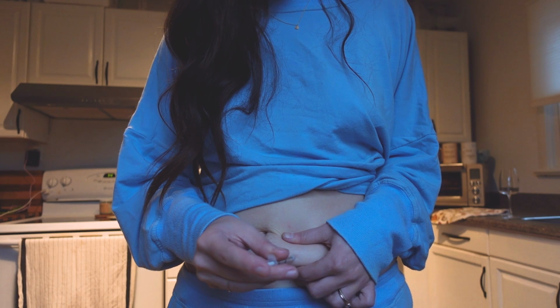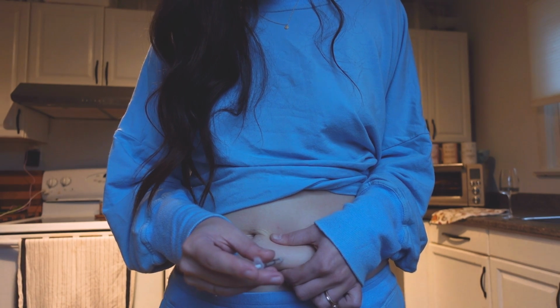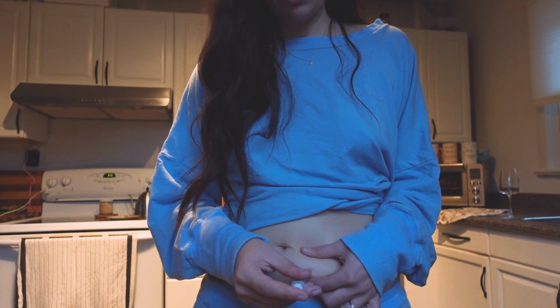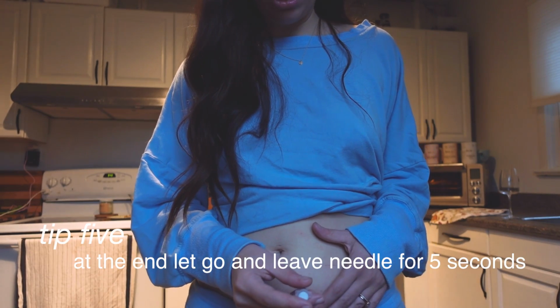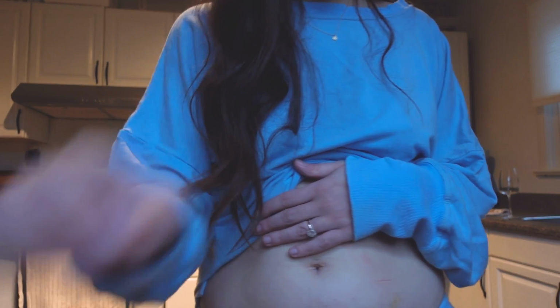You just, hi. And then once it's all in, you just let go of the pinch, hold the needle in for a few seconds, and then pull it out, and you're done.